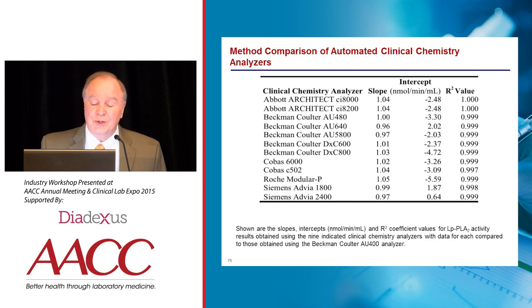Comparing all of these other instruments to that instrument and running this method, we get essentially no difference in the results. We can accept the null hypothesis that there's not much difference between the assay, regardless of which laboratory you run the assay in. Very exciting. I don't think I've ever seen any assay that shows this kind of correlation between different laboratories. Well, what's the secret sauce here?